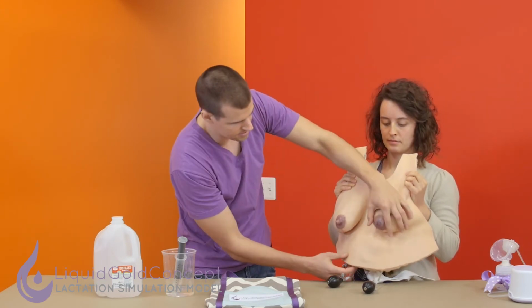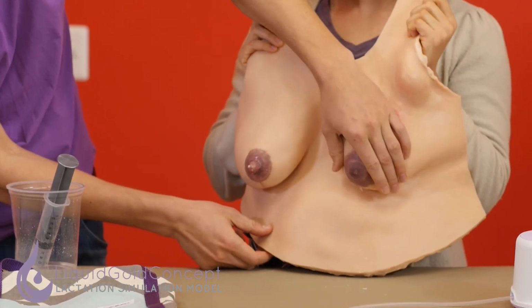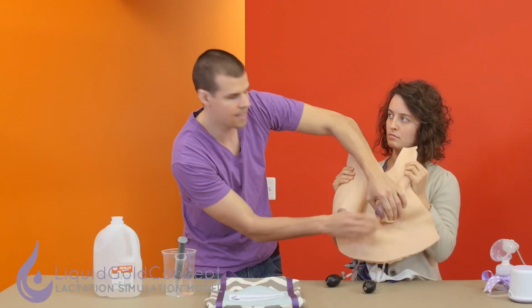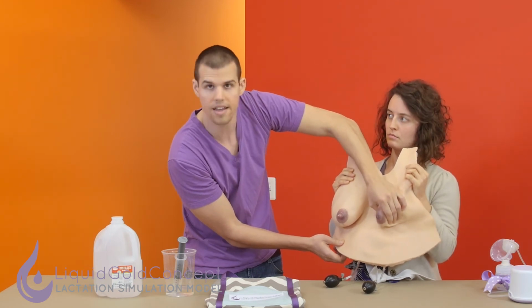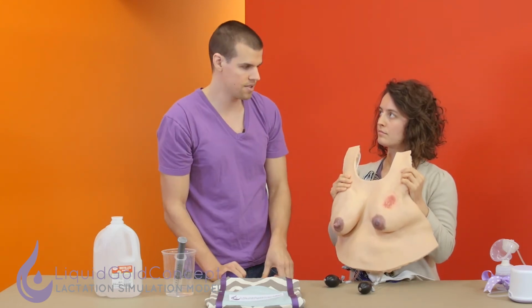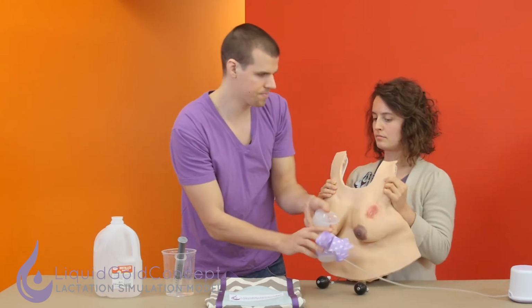So what we'll do is test first by just doing our normal hand expression technique. And if we don't get any water coming out, we'll reach a little bit deeper and you can find that lactation circuit and we'll just gently squeeze on it. This might take a minute or two, but eventually you'll get water to start coming out and you know it's ready to use.